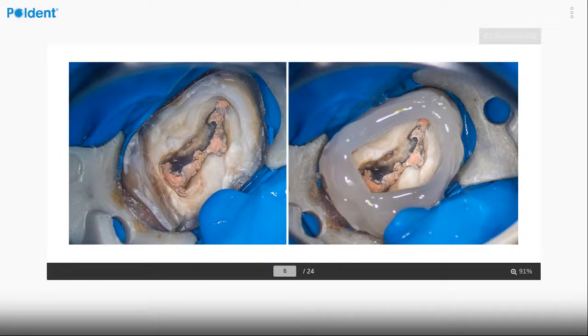So I want you to watch, not only see, but watch the pulp chamber, and you can see that there is a lot of filling material, mostly gutta percha and some kind of sealer, I believe the Endomethasone sealer, and some undiscovered places. And these places are the most interesting. This is the MB2 canal, for example. This is one of the spaces.